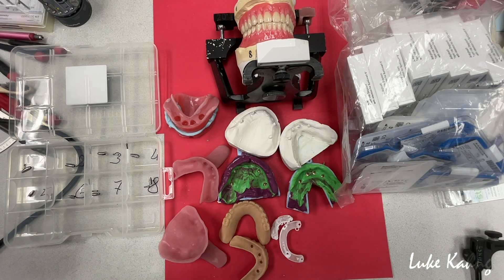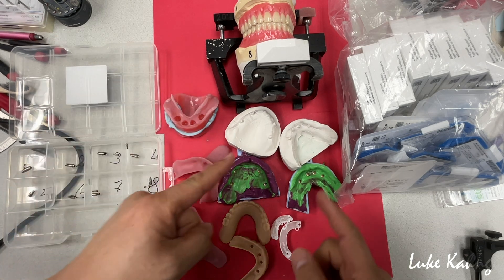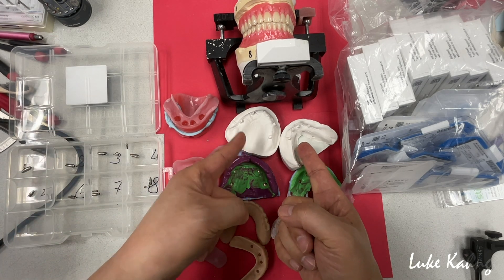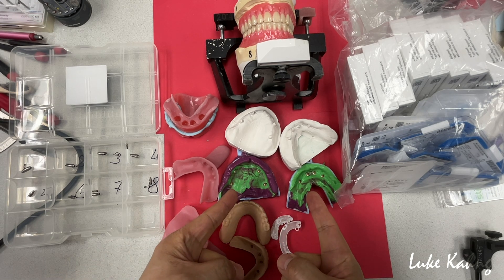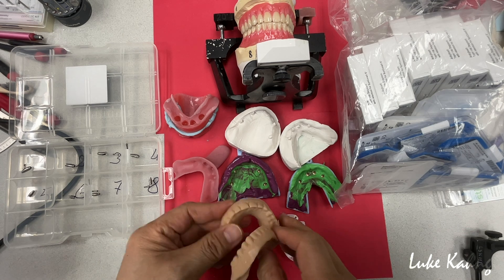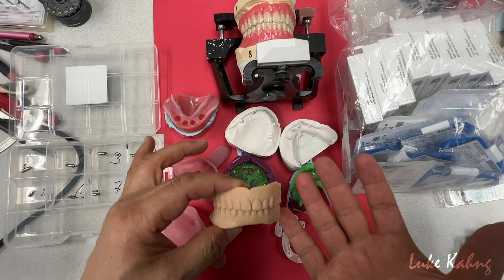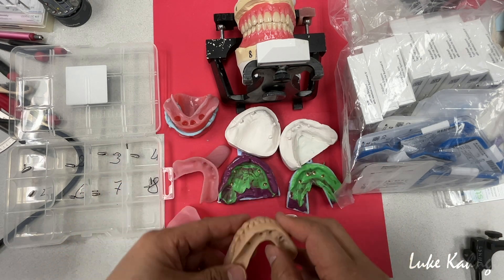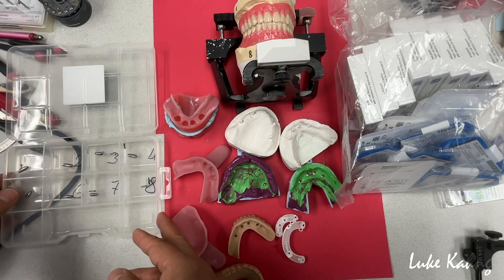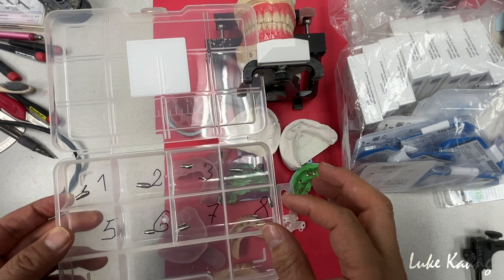Now we're talking about the conus implant cases. This doctor presented really well. This is the before impression. This is a custom tray. Doctor took the impressions. Here is the print in an old denture, which is what the patient wears. This is a great guidance to fabricate it.